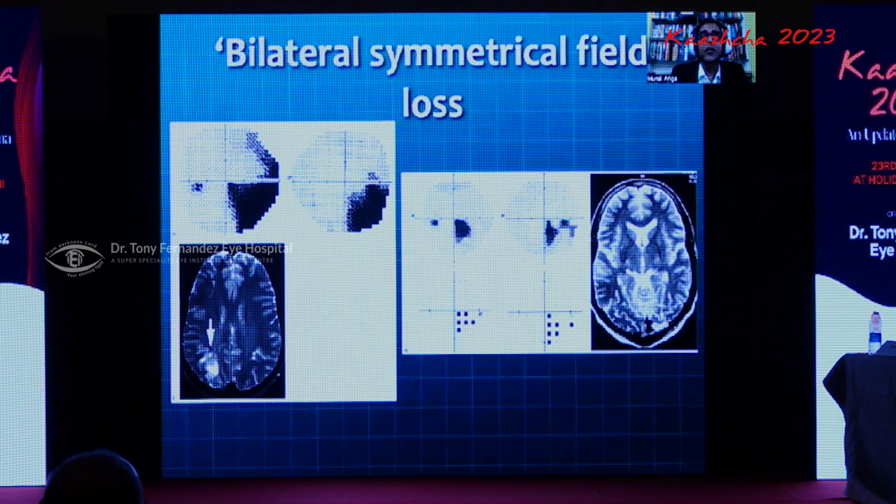But the problem would come with the bilateral symmetrical field loss. When you have one single field which looks like this and you have the other field in a different page, you don't keep both side by side. You will not interpret it as being some bilateral symmetrical or slightly asymmetric field loss.